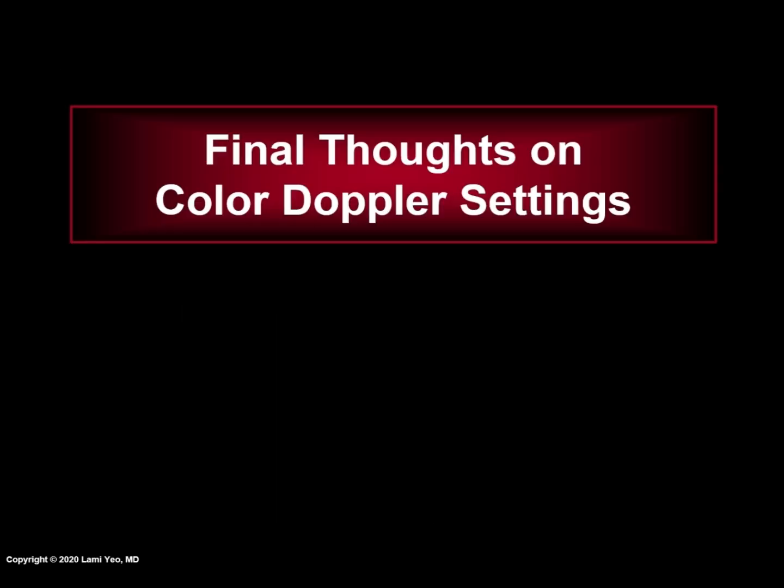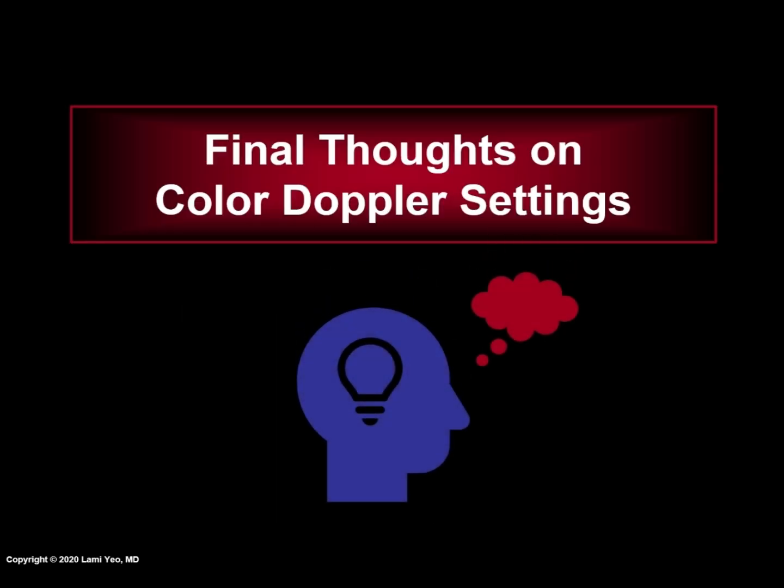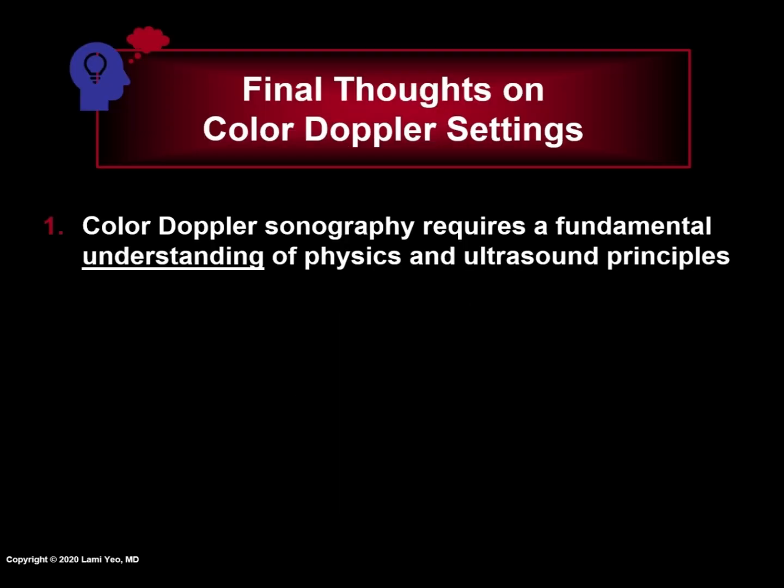Before we conclude this presentation, we would like to mention some final thoughts on color Doppler settings. First, color Doppler sonography requires a fundamental understanding of physics and ultrasound principles. Once this is achieved, this modality can become a valuable and integral component of fetal cardiac examination. By understanding color Doppler settings and how to adjust them, both the quality and reproducibility of color Doppler recordings is improved.